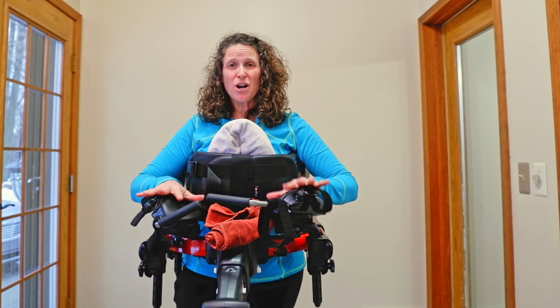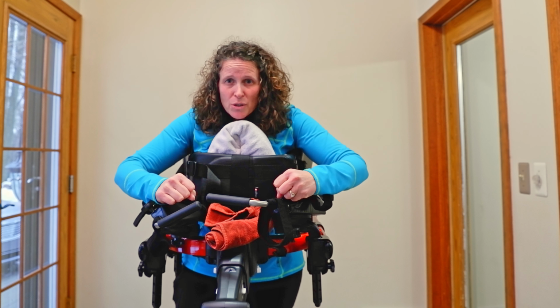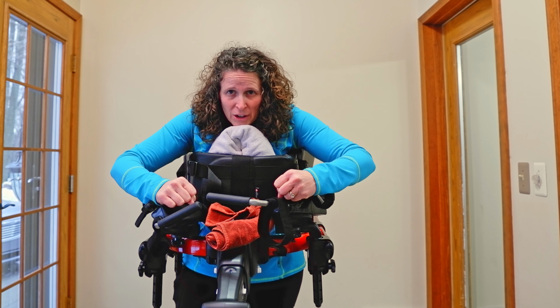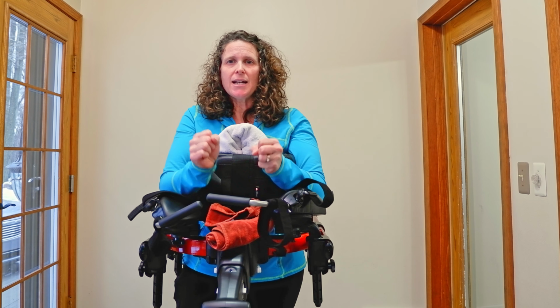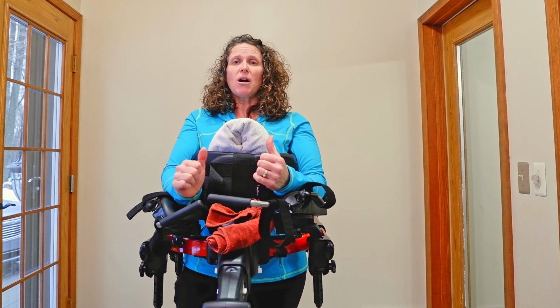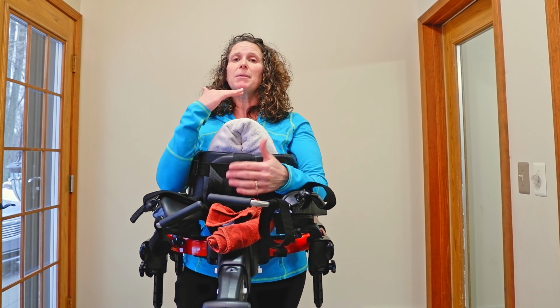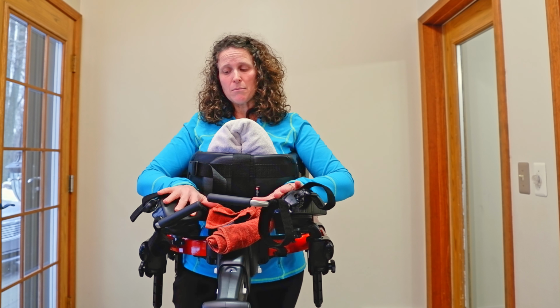I would also make sure that my arms are in a good position, because even if you have this towel roll in front and their arms are out here and they have low tone, they're just gonna drop further forward. But if you have their arms tucked in nice and close to them, not high but down, it allows them to rest, put their head down, but then they can push up with their arms and use their arms to push their trunk up, and it also helps with their head control. You might need to adjust the armrests so that they are the right height. You might have to adjust them on the inside versus the outside. You could also possibly change the angle of the arm prompts.